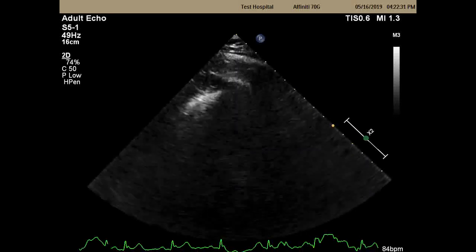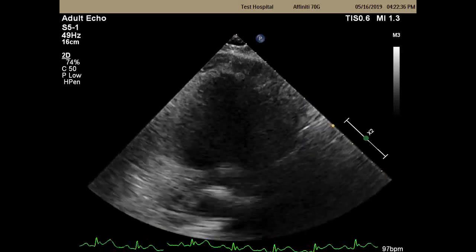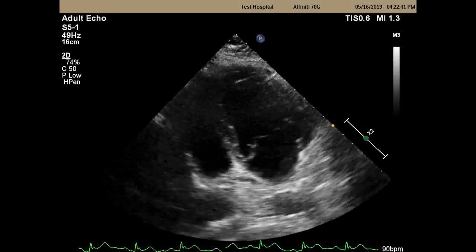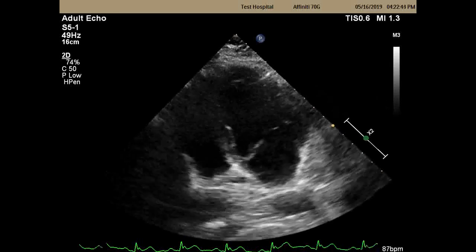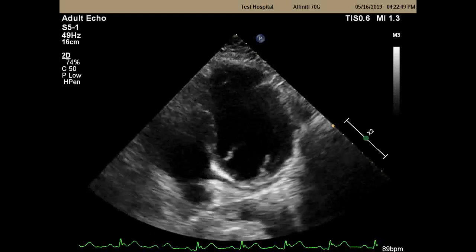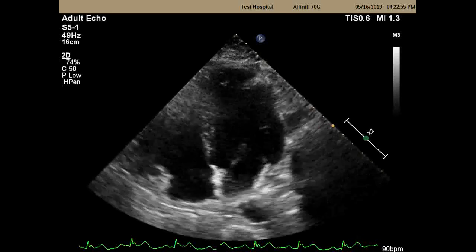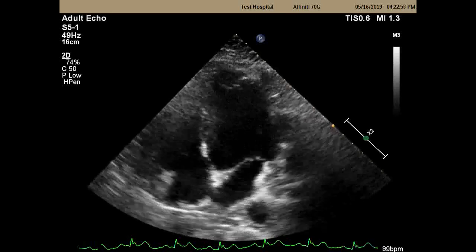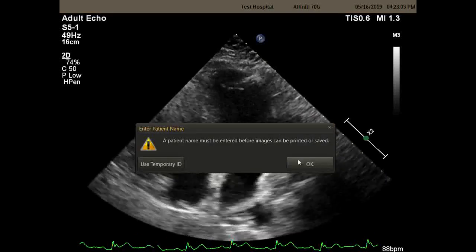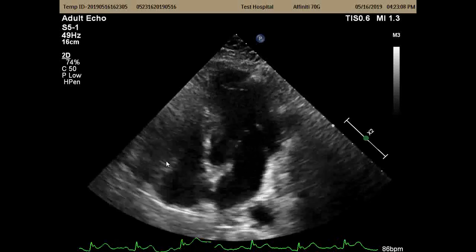But if I'm in a critical care type situation, and I have a patient who I can't get better images than, let's say, my angle, I'm gonna try to create an angle here that is like 30 degrees. If that's all I got, I can still do speckle tracking. My Doppler data is gonna be invalid at that angle. But if all I have is that 30 degree side tilt angle, and you've gotten that in some patients before, I do, I'll admit it. Sometimes that's all you got. Well, strain, we'll use the temporary ID. Strain is angle independent. It's probably one of the key features.